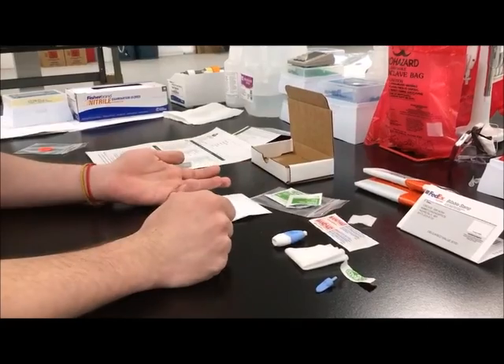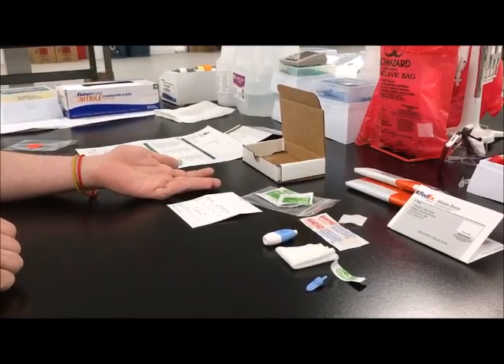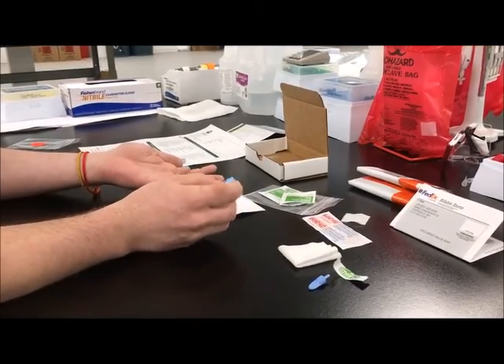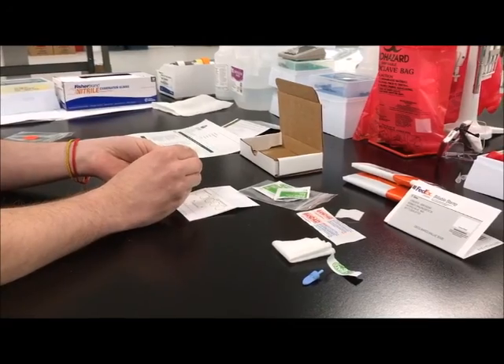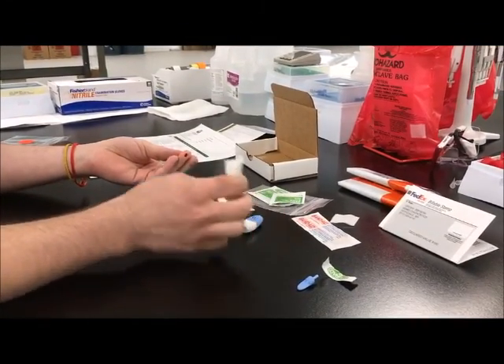Lay the hand palm side up on a hard surface. Place the lancet on the chosen finger off center as pictured in the instructions. Depress the button firmly until it clicks to activate the puncture device. Wipe away the first drop of blood with the gauze.